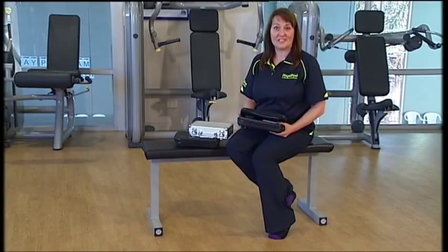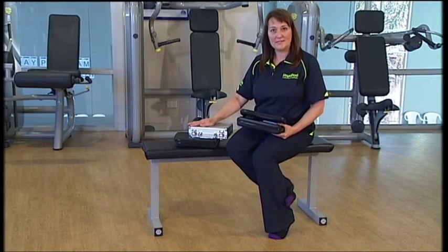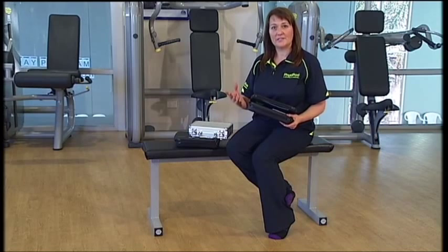Physipod offers a terrific range of electrical stimulators. These are nerve and muscle stimulators and their function is primarily to reduce pain, improve blood flow, circulation, relax muscle spasm and just improve circulation generally through an injured part. It can assist with tissue healing and it can also assist with wound healing.